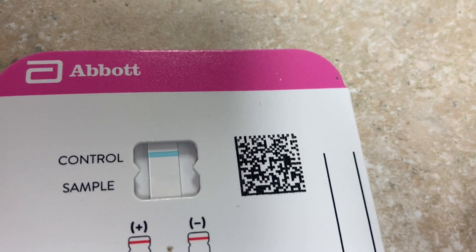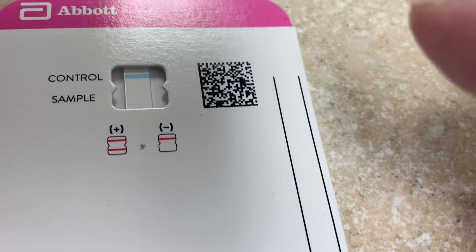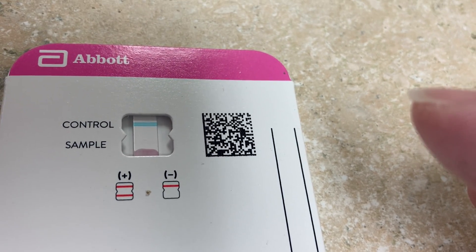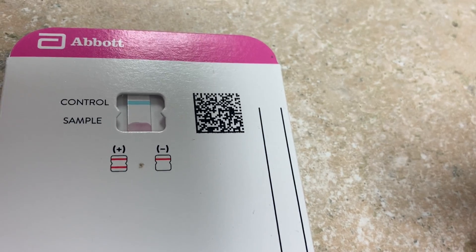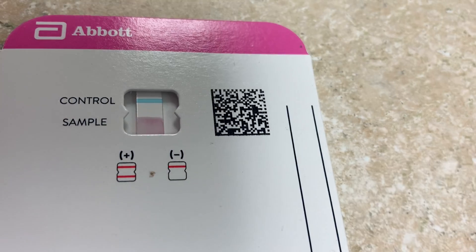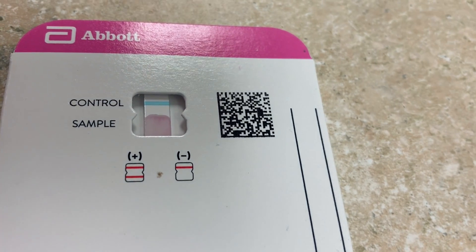You're looking at the blue marker — that's for the control. Now we have to wait 15 minutes. It's 10:20, so 15 minutes would be 10:35. You can see the solution is going up.